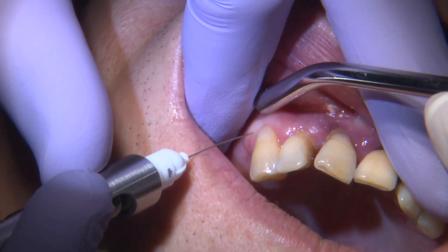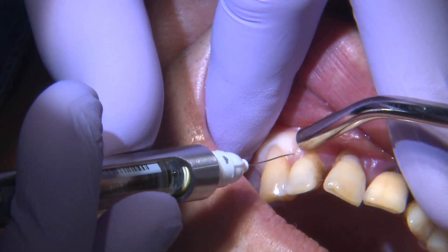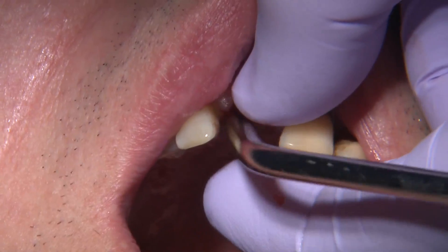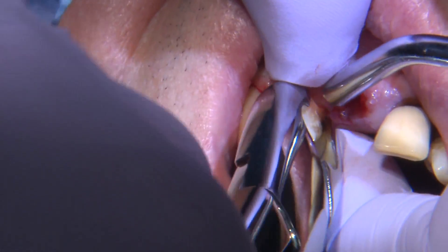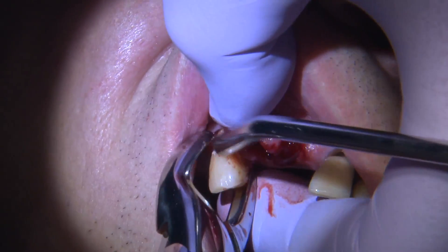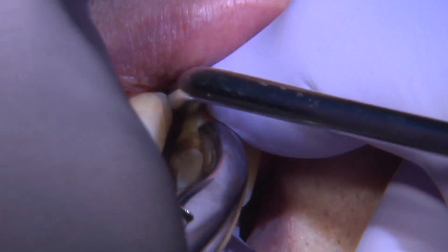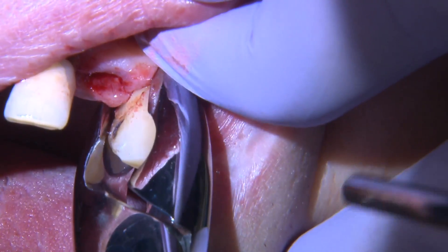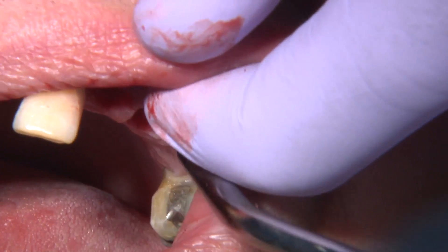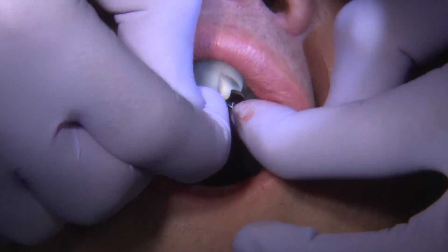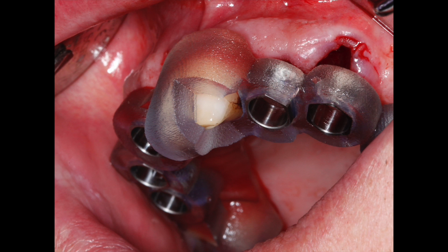When the patient comes back, I start with a selective extraction of the teeth we want to remove so that the predetermined surgical guide can sit on the remainder of the teeth. One by one, I elevate — taking care not to break the buccal plate in order to preserve as much bone as possible, since the surgical treatment plan is based on the available bone as-is. Once the extractions are complete and the three teeth remain, we can seat the surgical guide. There are windows built into the guide to confirm it is fully seated on top of the teeth.